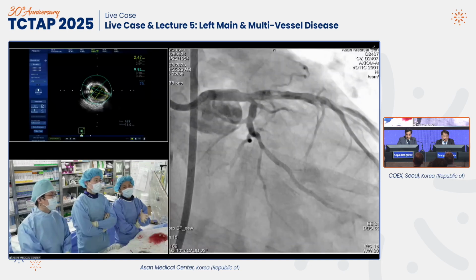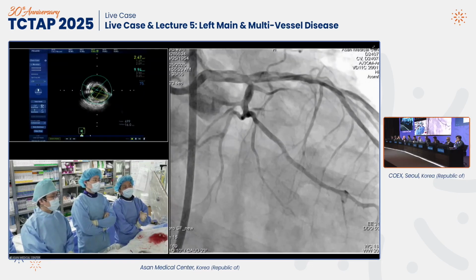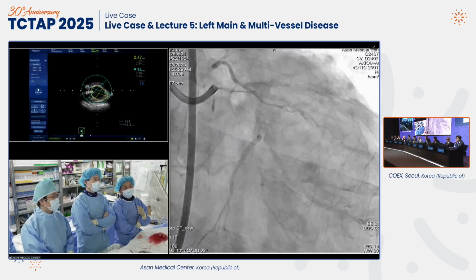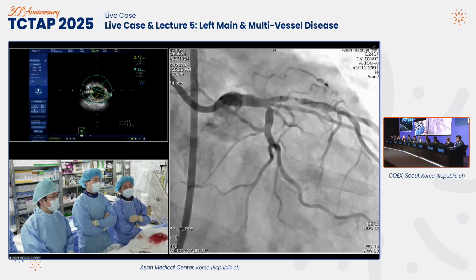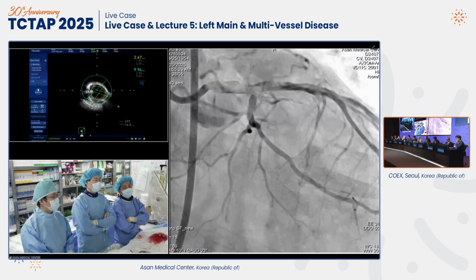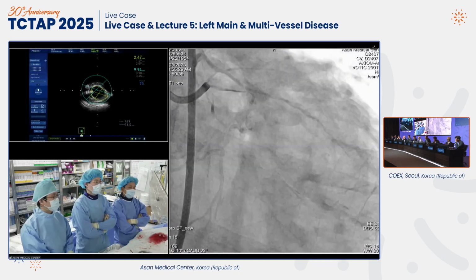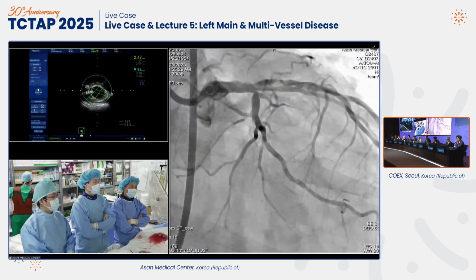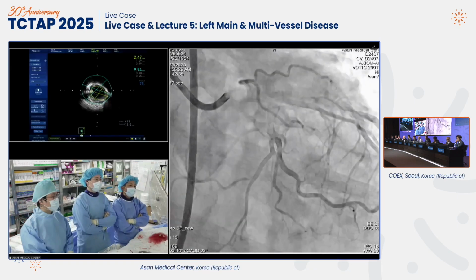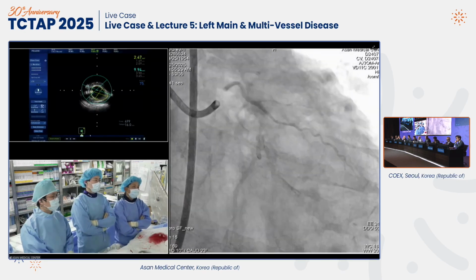If the patient has a lumen size less than 3.7 and plaque burden more than 67%, the acute event after crossover was more than 15%; the patient needed treatment for severe chest pain or shock or acute closure. So with that concrete data, we prefer to perform the two-stent technique if the circumflex ostium is diseased with more plaque burden like this, 75% and lumen size 2.5.